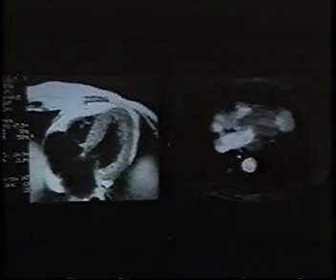On the second echo, slow flowing blood will have an increased signal, whereas clot will have a decreased signal. It does not hold in every case. And lately we've gone more and more to doing gradient echo movies, since flowing blood will look white, whereas myocardial tissue, this is a hypertrophy also with an aneurysm at the apex of the heart, will look more gray. So if we can see flowing blood like this, I think we can reasonably exclude the presence of thrombus.